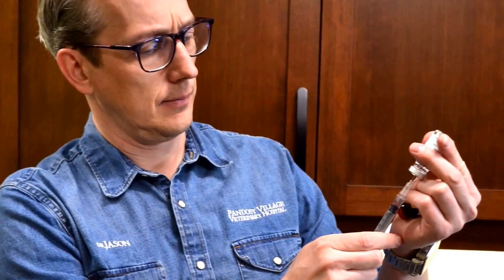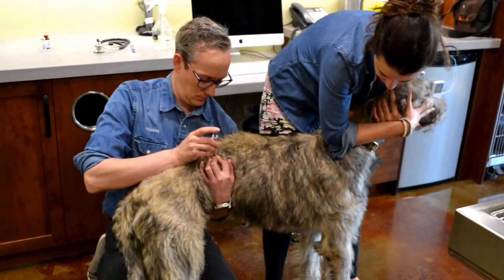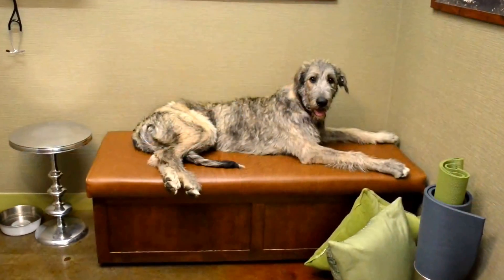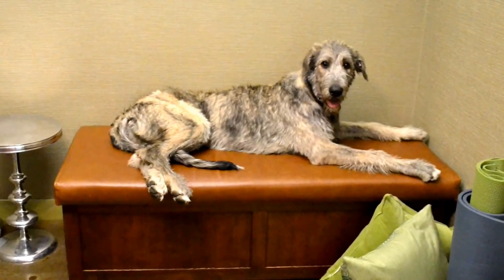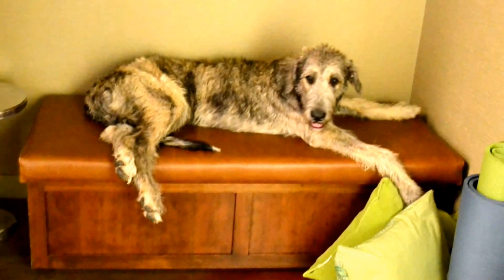Today, we are performing a PennHip evaluation. First, we sedate the dog with a reversible sedation. Tully doesn't like needles very much, but it only takes a second. We usually place the dogs in a nice, quiet room to settle down. It takes about 10 or 15 minutes for the sedation to start kicking in.